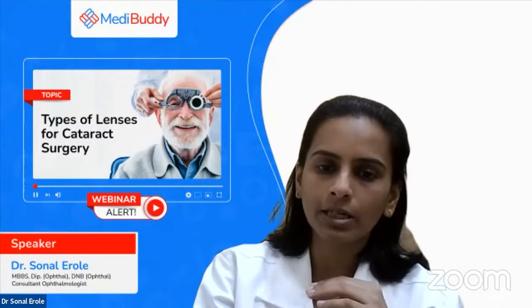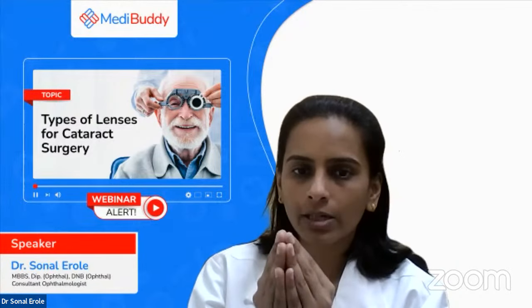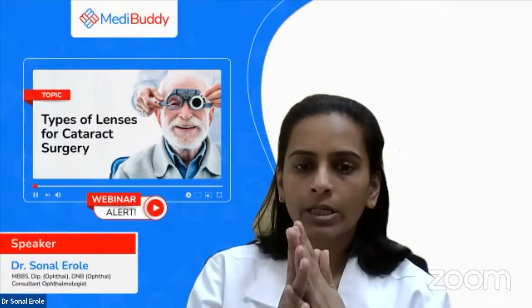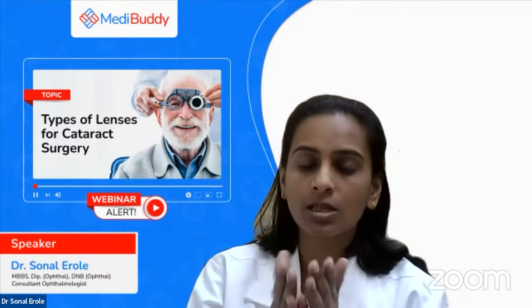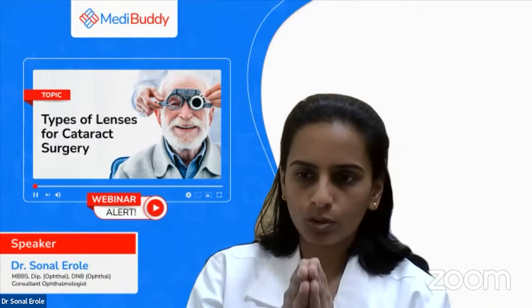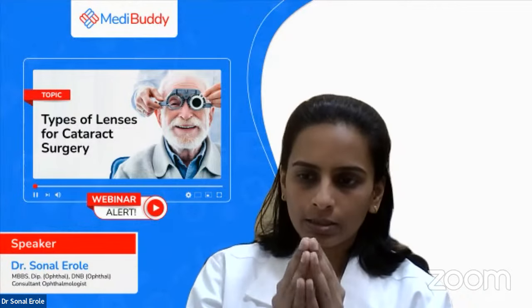In the olden days, there was a concept that until and unless the cataract is fully mature, a white cataract, no operation is to be done. But nowadays, with newer advances, with phacoemulsification, with these laser surgeries, we can remove the cataract even at the earliest. It means if the patient is having a problem, then we can remove the cataract.